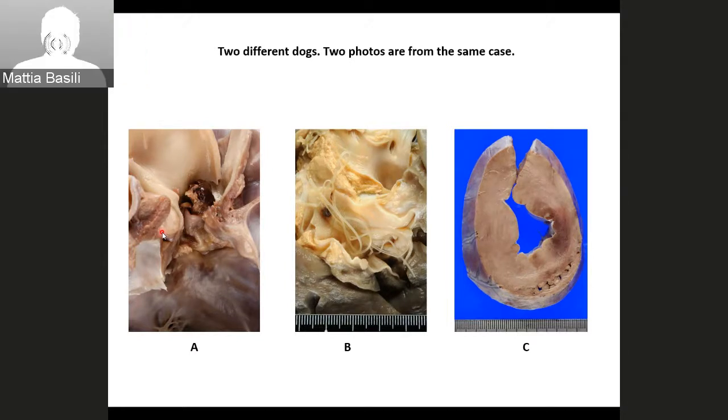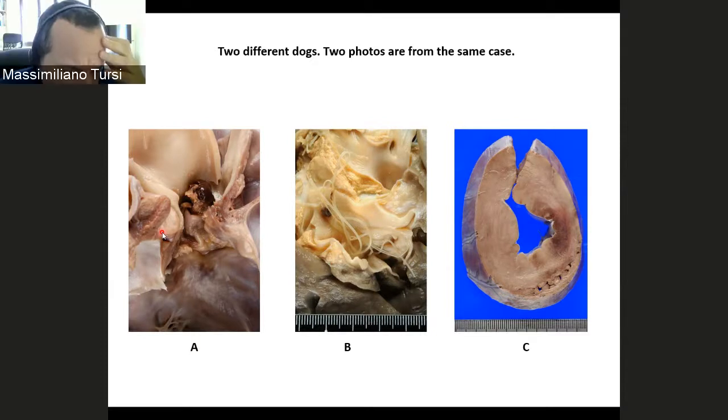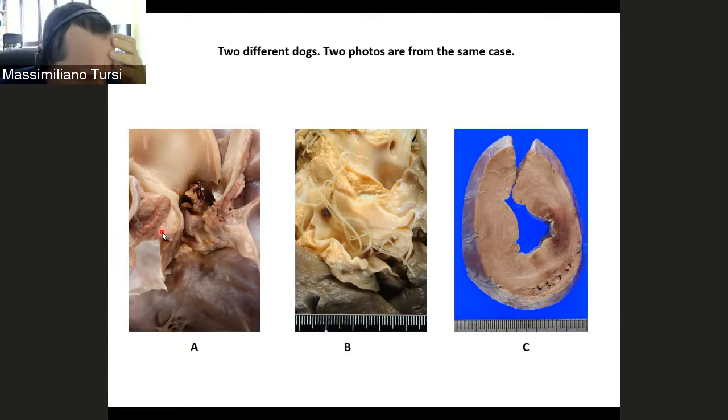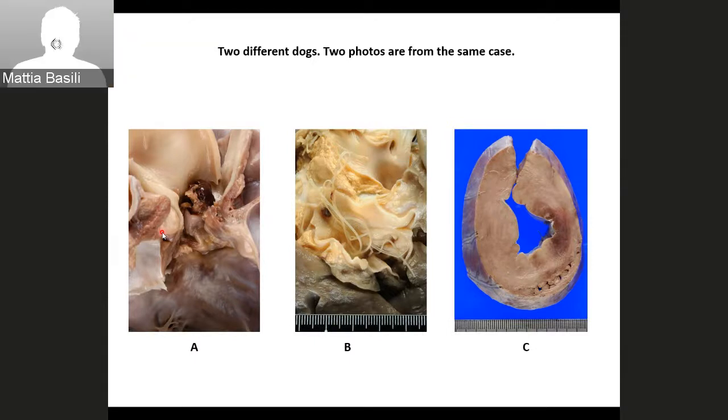Usually in the myocardium the shape of the ischemia, of the infarct, is not so characteristic. Usually we see the difference of color. Sometimes it's irregular, small, larger, so it doesn't matter. But in the kidney, usually it's very triangular with the apex closer to the medulla. Perfect, okay. Other question?